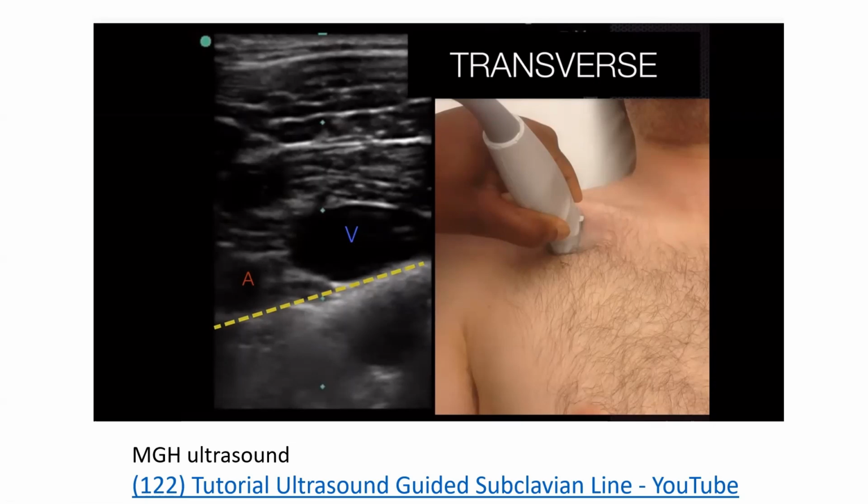In somebody with severe heart failure and ventricularized RA waveform, the vein may not be compressible and it may be pulsatile. So try to use Doppler, including spectral Doppler, to definitely differentiate artery versus vein. Size also helps. The vein is larger than the artery, typically, except in the hypovolemic or very hypovolemic patient. But in that case, the vein will be very collapsible spontaneously, and you will be able to identify it that way. In heart failure patient, typically the vein is larger than the artery.